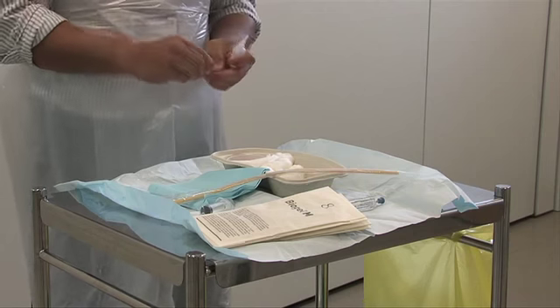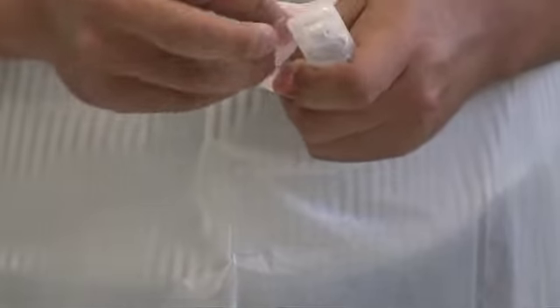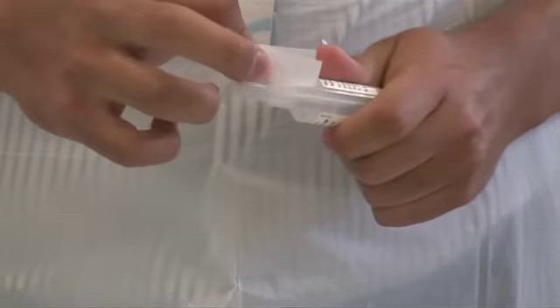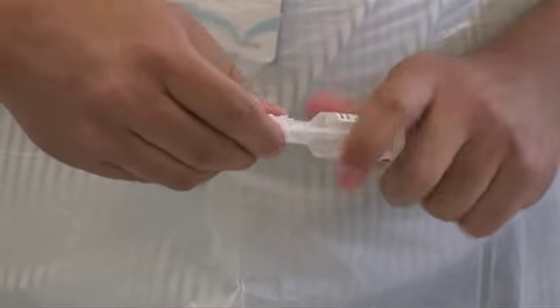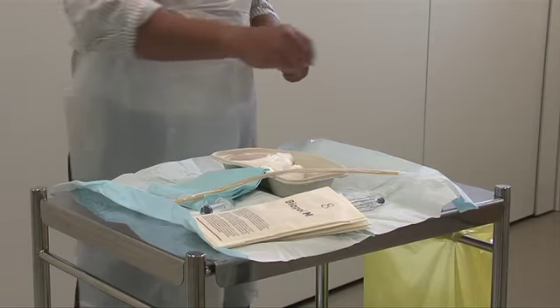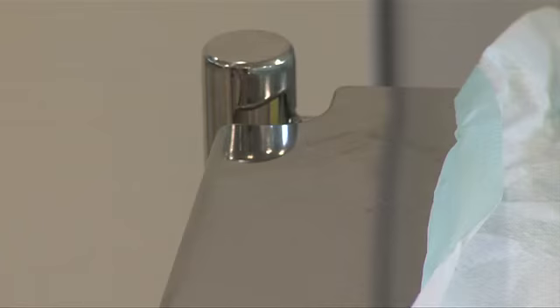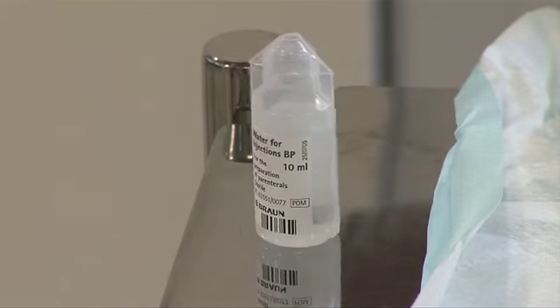Cleanse the container of sterile water using an alcohol wipe and remove the seal from the ampoule. At this stage, double glove before proceeding.